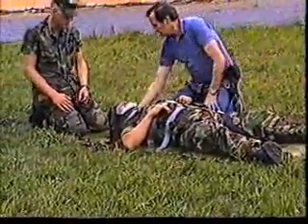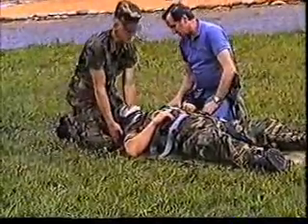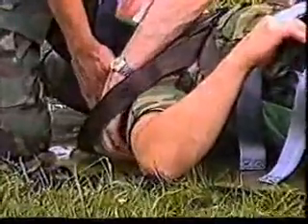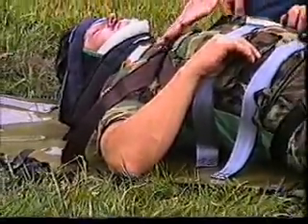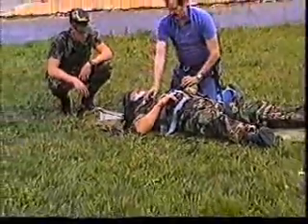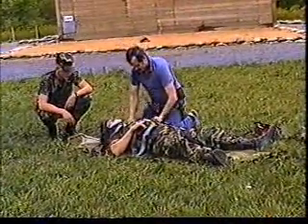Let's take a look at that. If I can get you to take this underneath here, raise that up about 1 inch, just a little bit. Now I can slide this under here a little higher. There we go. Center this on his shoulders, now let him down. And that's going to protect him from having his shoulders compressed. And instead of crisscrossing here, like I said earlier, the only time we fasten these straps contrary to the color coding is if we want to retract the shoulders.